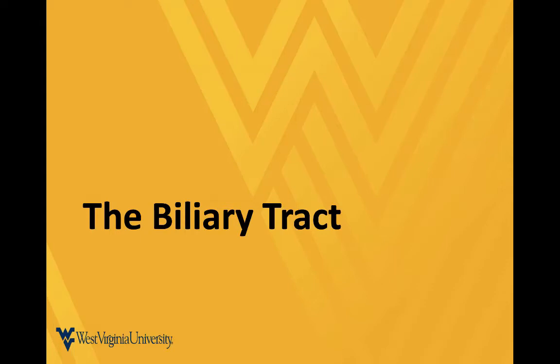Okay, so next up we're going to talk about the biliary tract. The biliary tract can be a common source of problems. Patients having gallstones and pancreatitis and things like that are very common. It can be a little bit of a difficult anatomy to get images of, just because sometimes patients have different anatomies. Sometimes they're in pain or they're obese or things like that. So getting practice and getting good at the anatomy is really important.